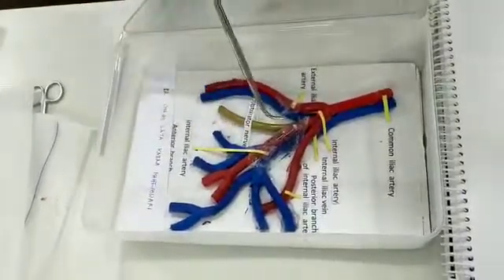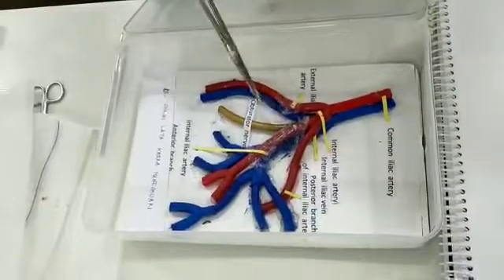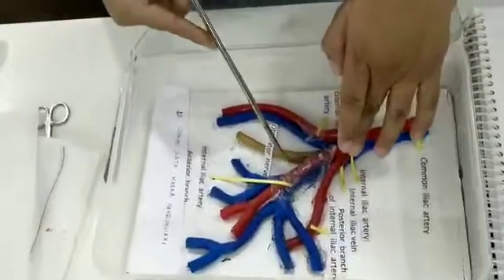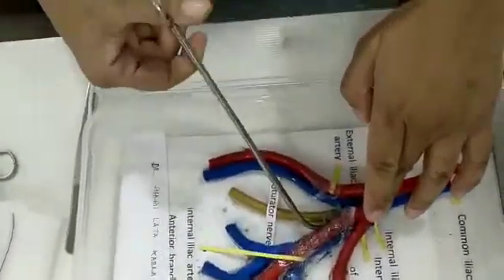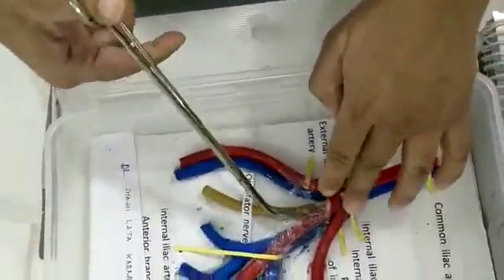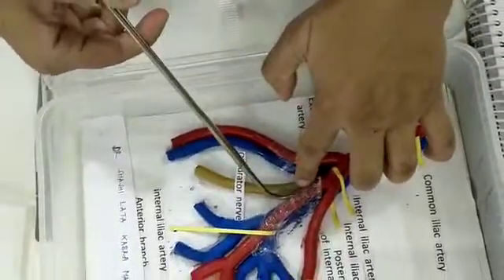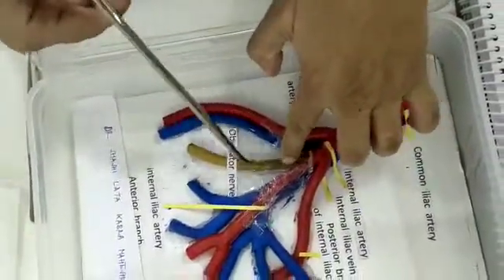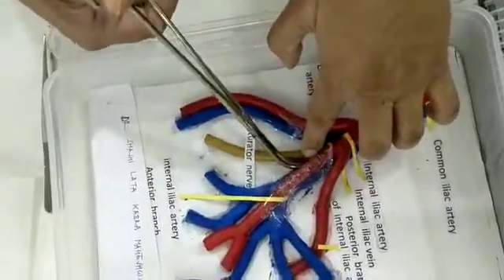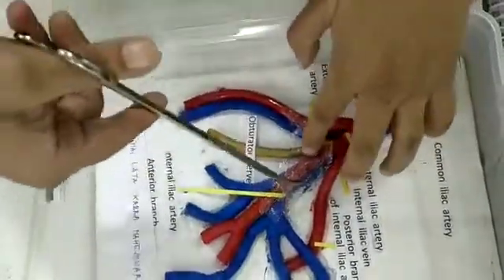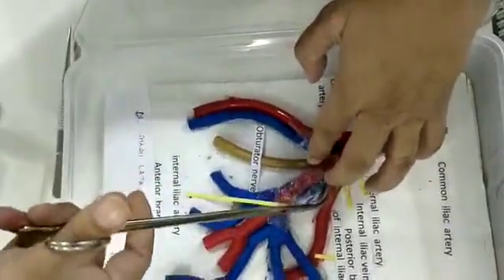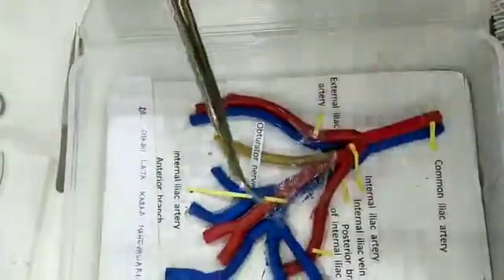I make a space only at the place where I have to introduce the right-angle forceps. This is how I do it - I do this dissection here and on the other side also. Then my assistants keep this here.